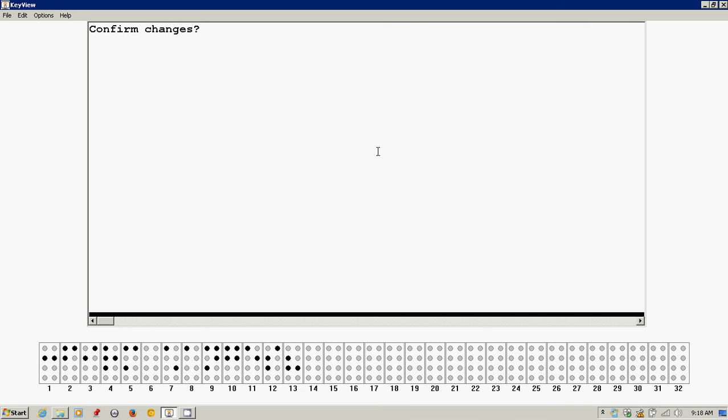Yes. Your device is now protected with a password. Braille terminal port, currently Bluetooth. And now it's saying braille terminal port. What do you want to use, Bluetooth or USB? In most cases, you're going to be using a USB connection with a PC.